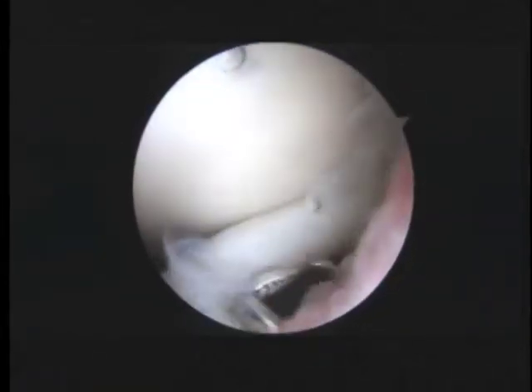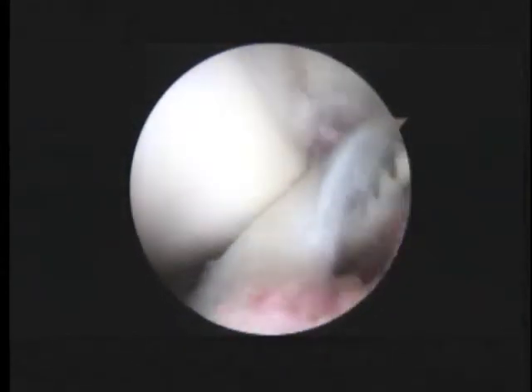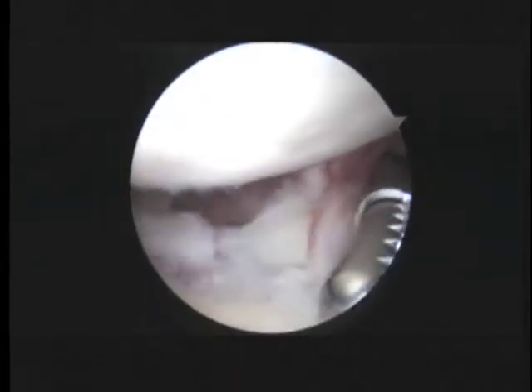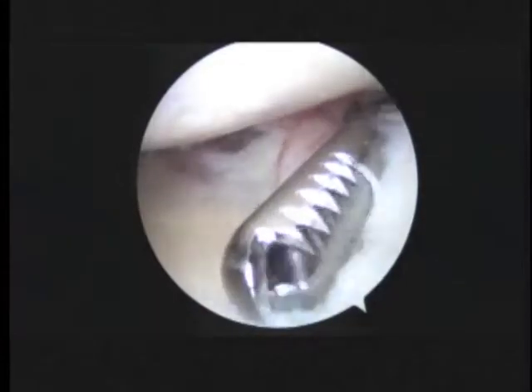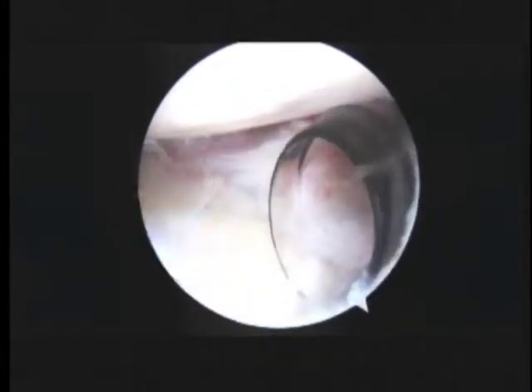So here we can see some tearing not only in the biceps but above. We'll start to see some tearing in the cuff, which is what we expected. Look back down here, about 4 o'clock, 5 o'clock. Go back a little bit. Okay, so I think the next thing we'll do is go ahead and get the biceps sorted out.